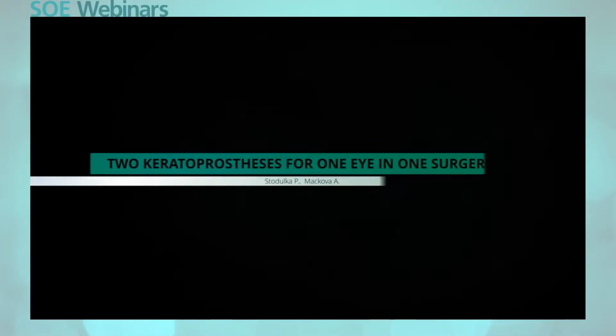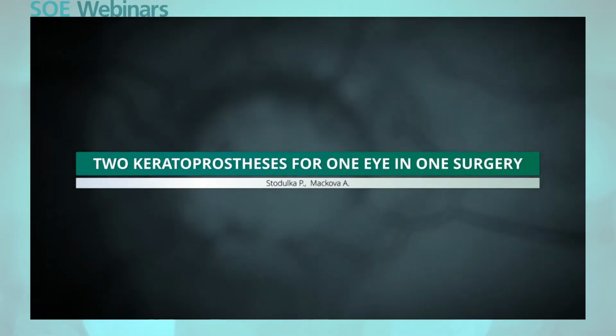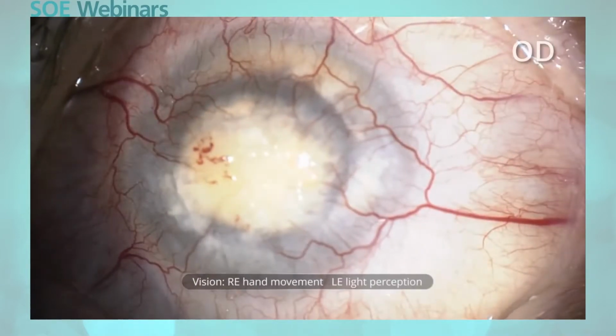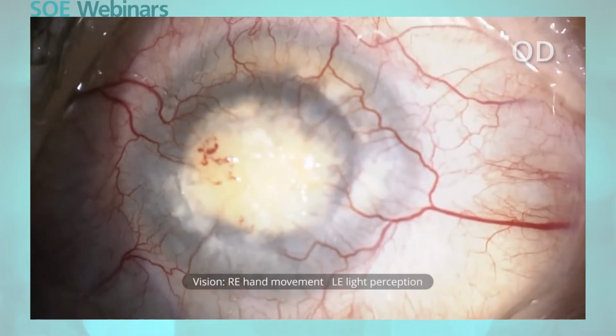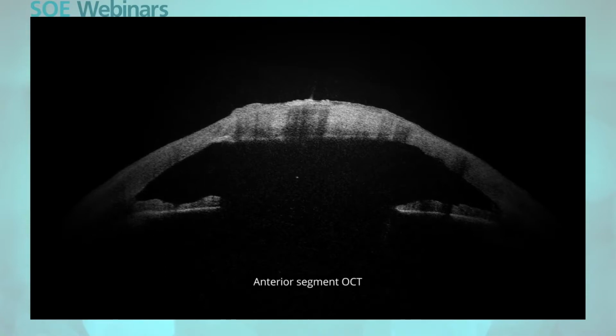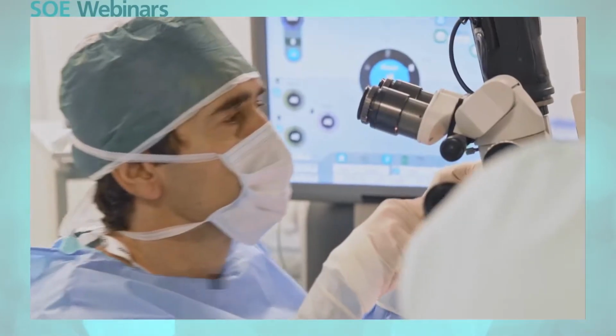This film is about a patient who was blind for 16 years and who had his vision restored by a surgery in which 2 artificial corneas were used. The patient could only see with his better eye hand movement with correct light projection. Because the cloudy cornea was thick enough, we decided to attach the artificial cornea in the patient's own cornea.